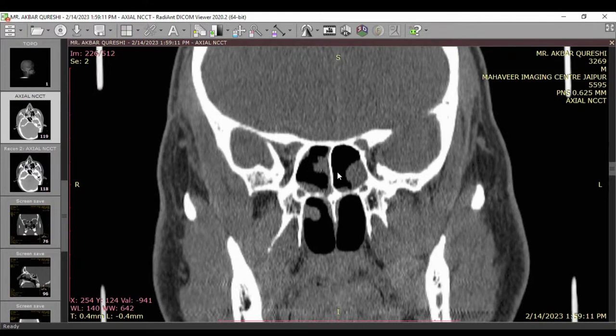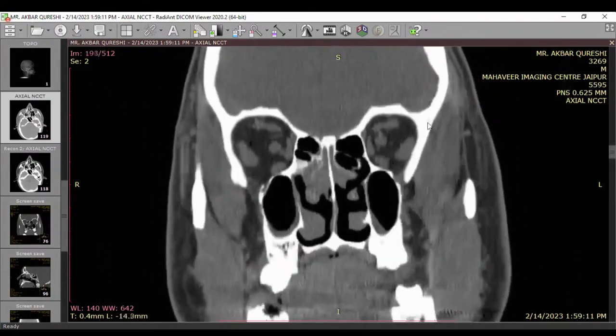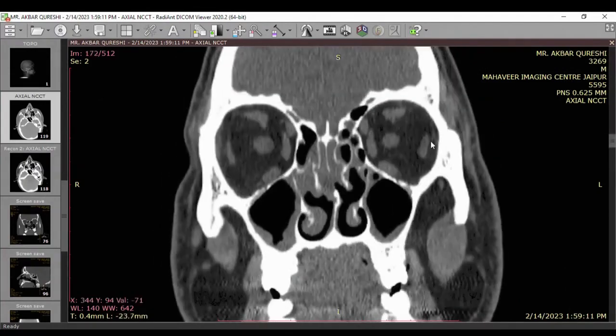Generally in CCAD, you preserve the turbinate. But your concern is the olfaction, you have to open up the access to the olfaction. So we will partially trim the turbinate. In general, any patient having disease medial to the middle turbinate, you have to do a partial turbinate resection to allow the topicals to reach the olfactory recess uninterrupted. A lot of interesting findings in these cases, in this particular case also. Any questions?